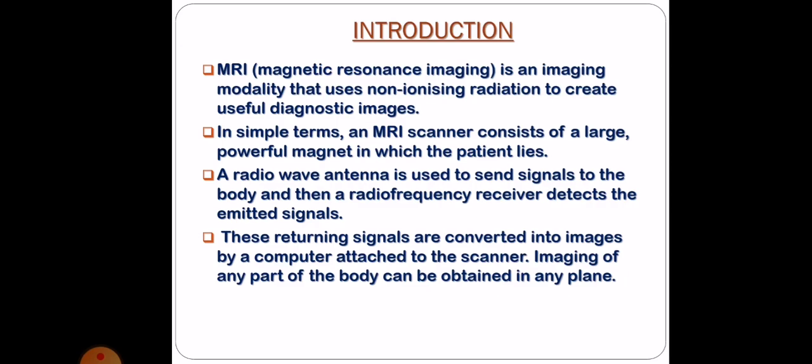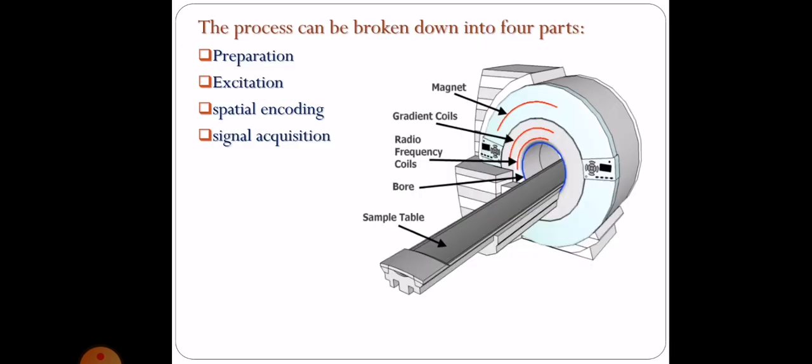And in CT, we see sagittal and coronal images are reconstructed from a set of continuous slices, but in MR, images are obtained directly from the net magnetic resonance signal rather than reconstructed from stacked transverse images. So further, we can know about the basic principles.